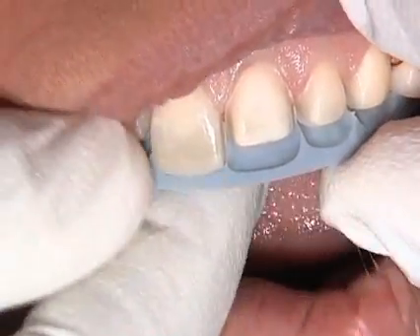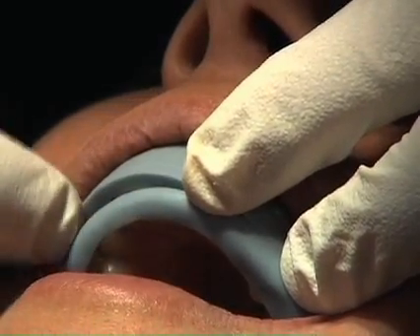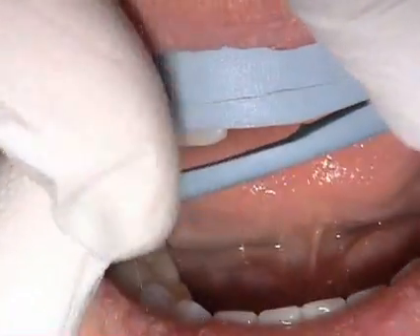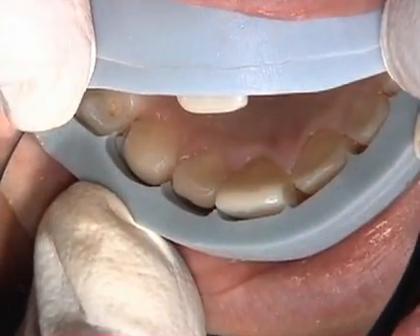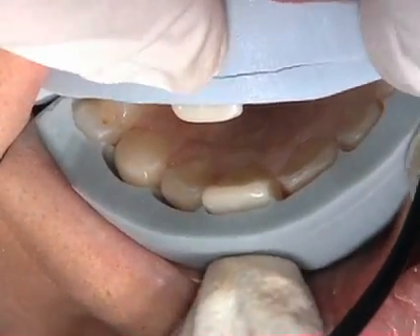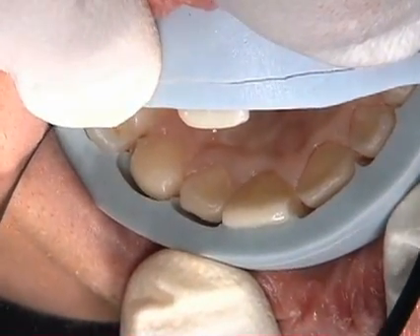In addition to an incisal index, you can use a facial index. The facial index is positioned, and you can see there are several cuts in it. Holding the facial index in place and retracting the first cut puts us in the incisal one-third. Using a mirror and trying to hold the index completely in position — sometimes it's a trick, especially on taping, to seat it completely on the facial aspect — you can see we have a controlled reduction tooth-to-tooth.